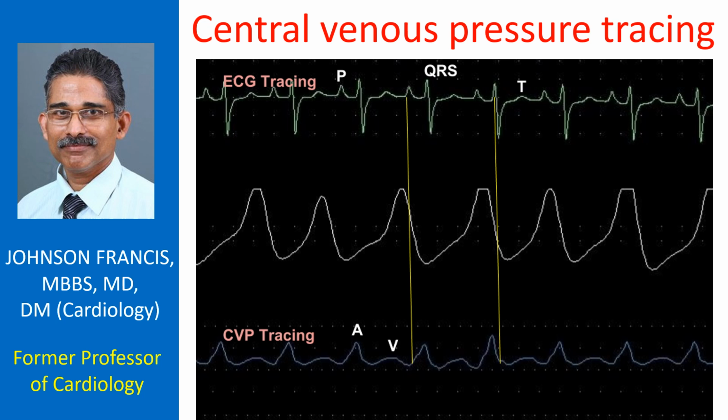If the central venous pressure is low while weaning off inotropic support, there will be a recurrence of hypotension. Intravascular volume may be low even with normal blood pressures while on inotropic support. This leads to fall in blood pressure while weaning off inotropes or vasoconstrictors.